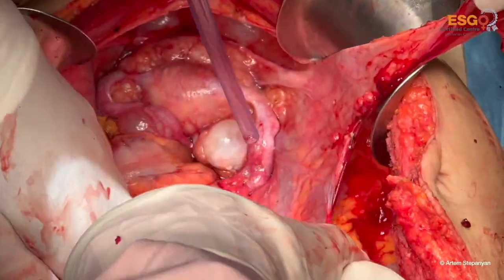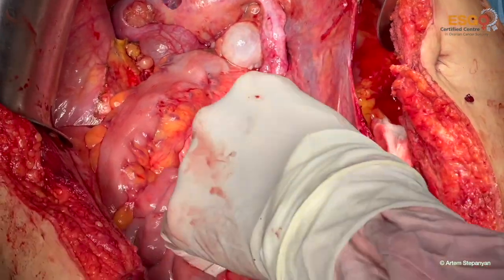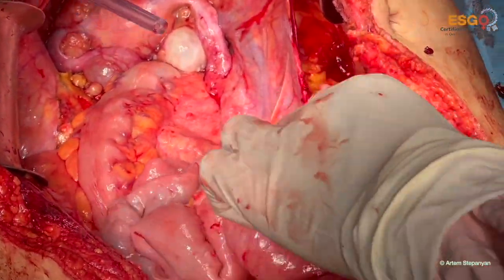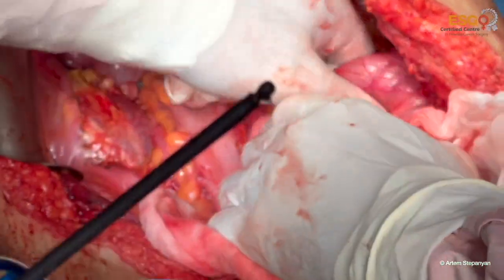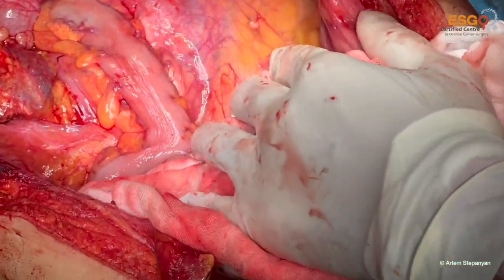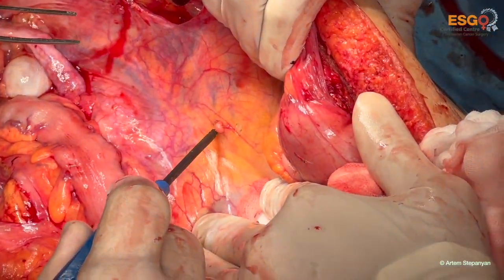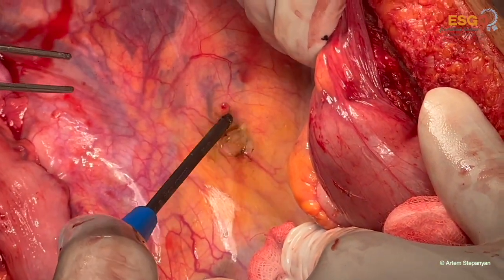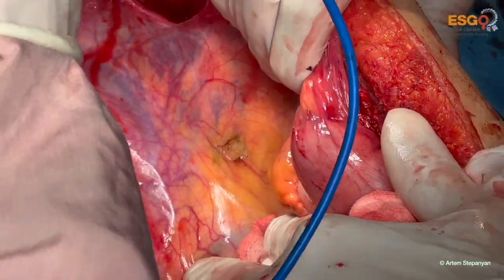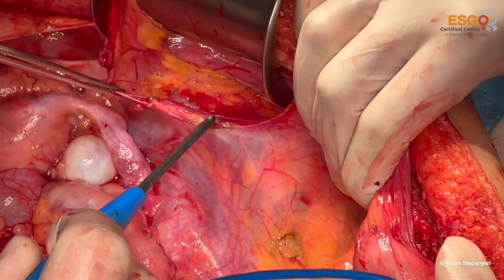And in the pelvis, it is essential to find the critical structures of the pelvis. Those are both IP ligaments, both ureters, on the left side, on the right side. Here we see the small implants close to the cecum.